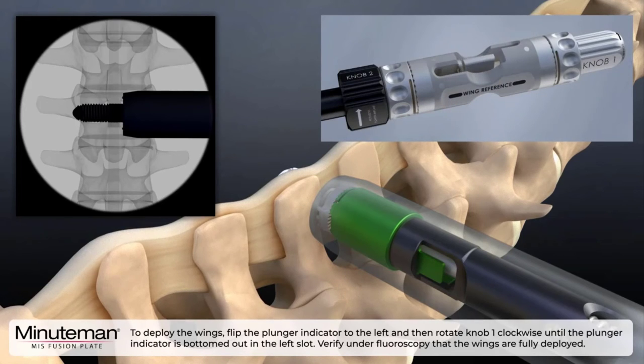To deploy the wings, flip the plunger indicator to the left and then rotate knob one clockwise until the plunger indicator is bottomed out in the left slot. Verify under fluoroscopy that the wings are fully deployed.